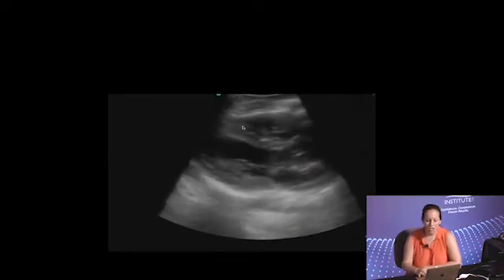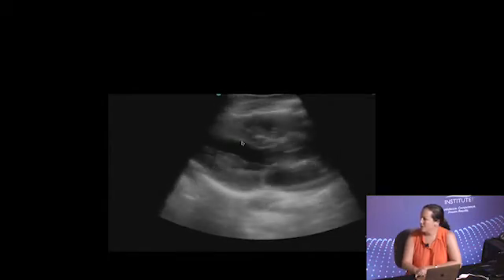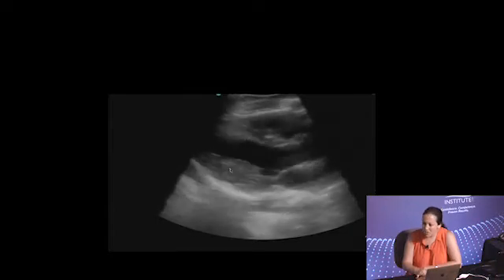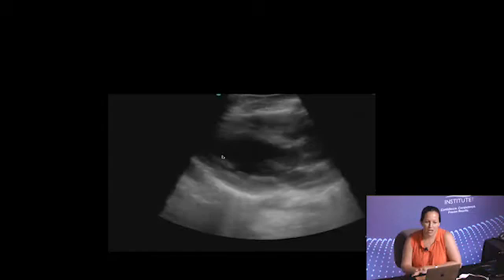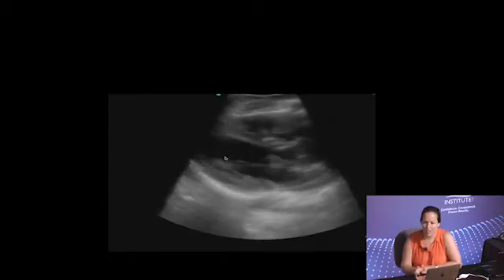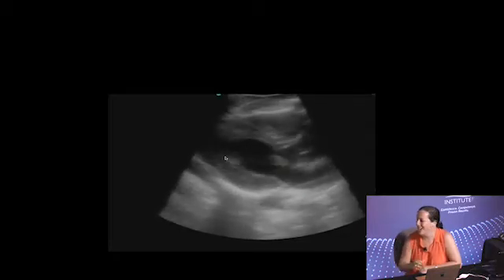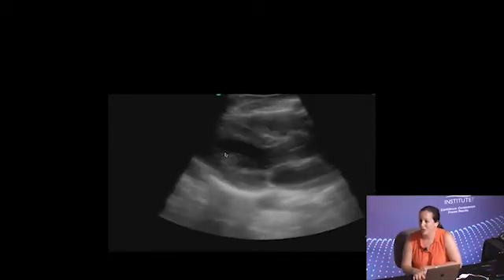Whether you change the indicator or you change the setting, the reason why I like this way, 4 o'clock in the abdominal setting, is that this is the image that the cardiologists see. So the left ventricle is here. Not all scanning happens that way, but I like having the same image that the cardiologist sees. So when the cardiologist comes and looks over my shoulder, they don't think that I don't know how to scan. That's my personal opinion, but everyone feels very strongly about their own way being the right way.